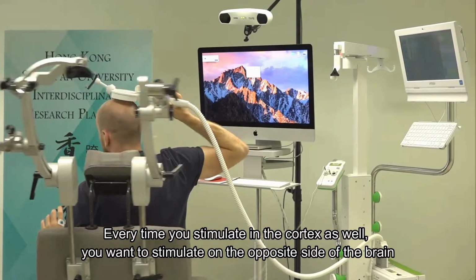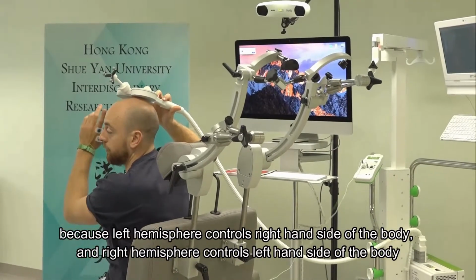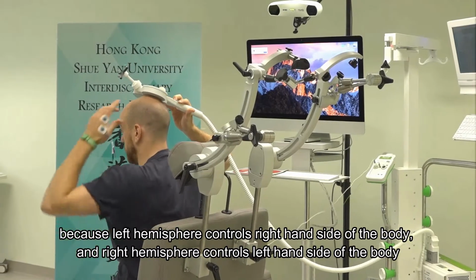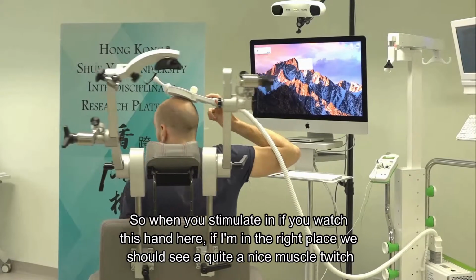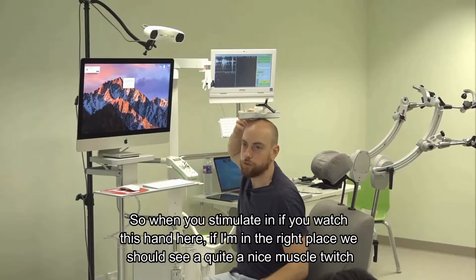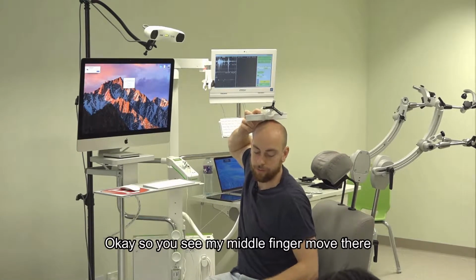Every time you stimulate in the cortex, you want to stimulate on the opposite side of the brain, because the left hemisphere controls the right hand side of the body and the right hemisphere controls the left hand side of the body. So when you're stimulating, if you watch this hand here, if I'm in the right place, we should see quite a nice muscle twitch. Okay, so you see my middle finger move there?